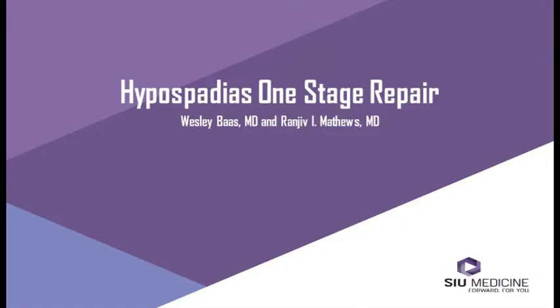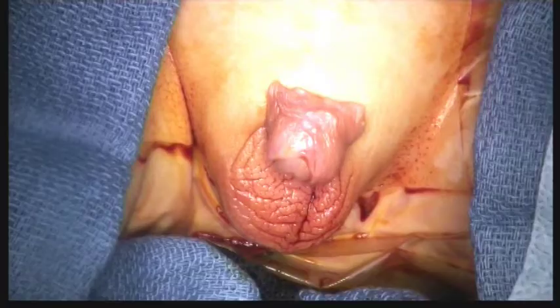The management of hypospadias has evolved to provide good long-term functional and cosmetic outcomes. Most repairs can be accomplished in a single procedure. Multiple successful techniques have been developed. This video highlights some of the steps that are common to many of the procedures used for hypospadias reconstruction.